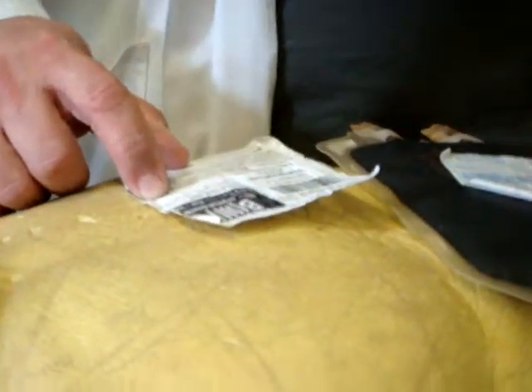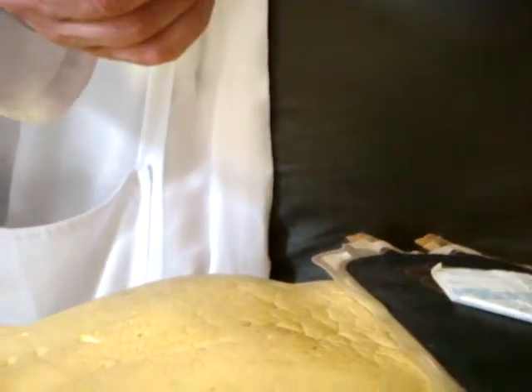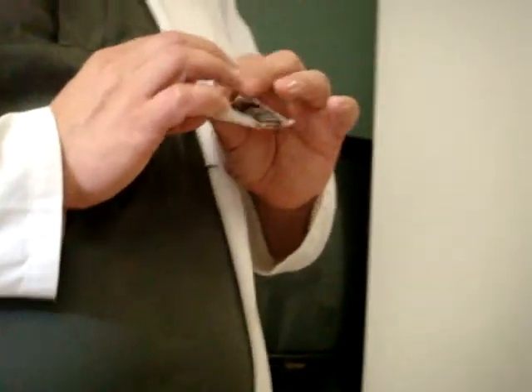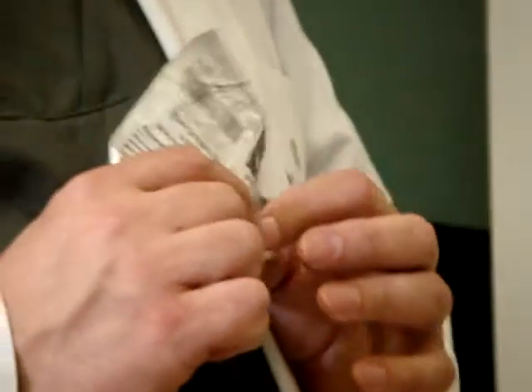Next, check the expiration date and the date of taking. In all cases in Russia, there must be the name of the donor — why? Because in all cases, doctors provide examination of donors to find diseases or signs of microorganisms or viruses. That's why the donor's name is required.